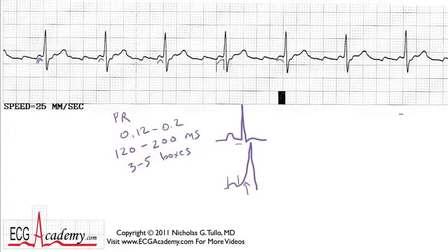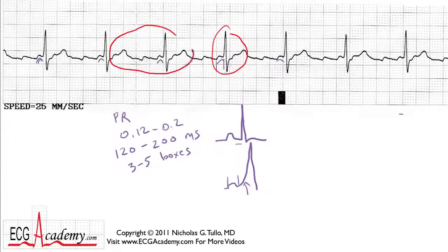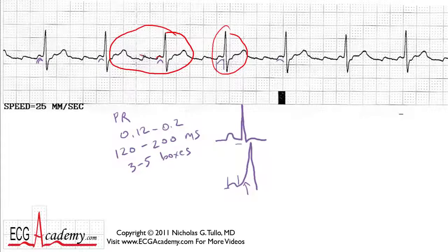But here's the trick — you really shouldn't just look at this; you have to look at the whole thing. Because if you glance at the baseline between these QRS complexes, there's a hint. In front of this little bump you think is a P wave, there's a flat segment, but it's not exactly flat — it's kind of slanted, it has a slope to it. So when you think about slopey things, what you need to think about are sawtooth waves. What does a sawtooth wave tell you? Atrial flutter.